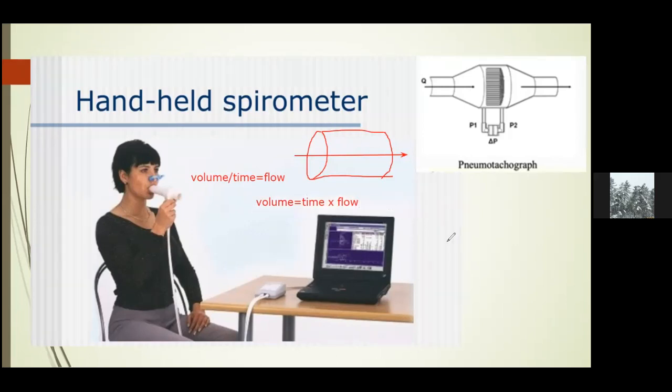Say, for example, you are blowing out, it goes up. Then when you are told to inhale, the air will move in the opposite direction. So if you are told to blow out, it goes in that direction. If you are told to inhale, it goes in this direction. So it will keep on alternating between one direction and the other.